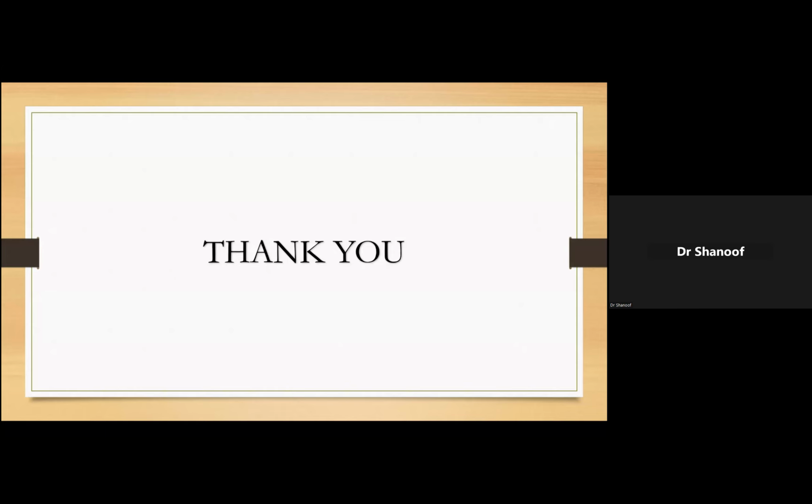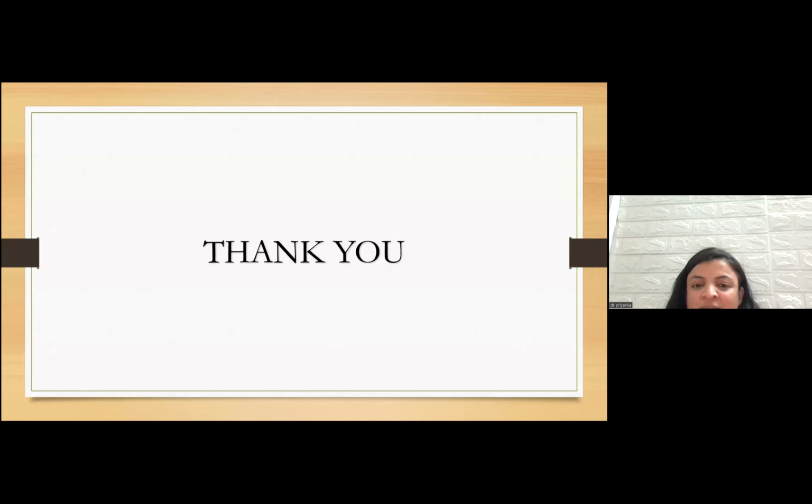Any time required for activation, ma'am? Definitely, you better do it for at least 1 minute in total, but not continuously. Otherwise, you are injuring the tissues over there. You can give it 20 seconds and then just switch it off.